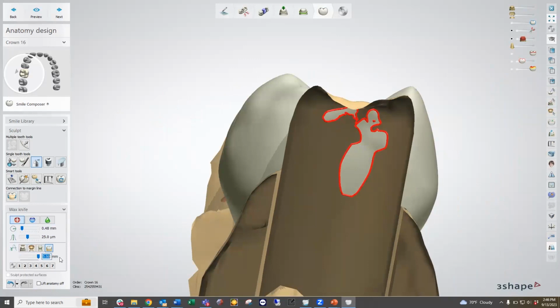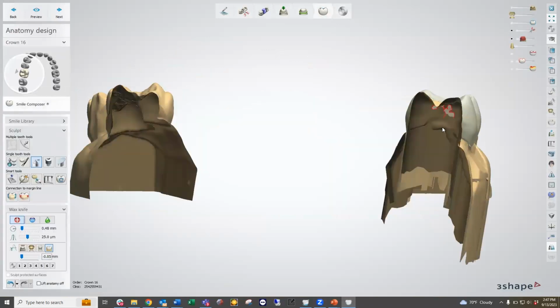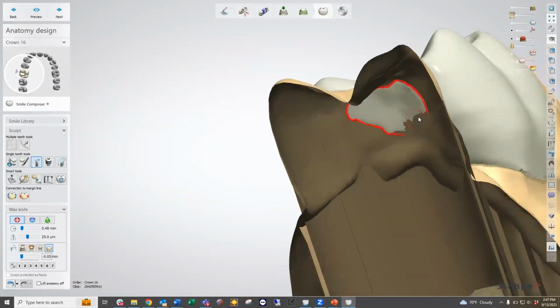undercuts here. I'm actually going to go the same difference that we had before. So I'm going to be adding all the way. Oops, sorry, I hit enter. I shouldn't have hit enter. That's my fault. Go back here. Okay, so I'm going to go and I'm going to be a negative amount on my neighboring teeth undercuts. And this is actually going to allow me to add in this area up to that specific amount. And the reason why I like to add in this area is because this is ensuring that this area is going to be into contact with our neighboring unit during that procession of the insertion direction.